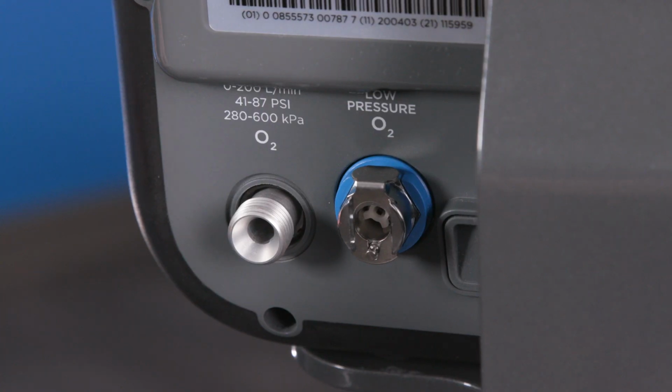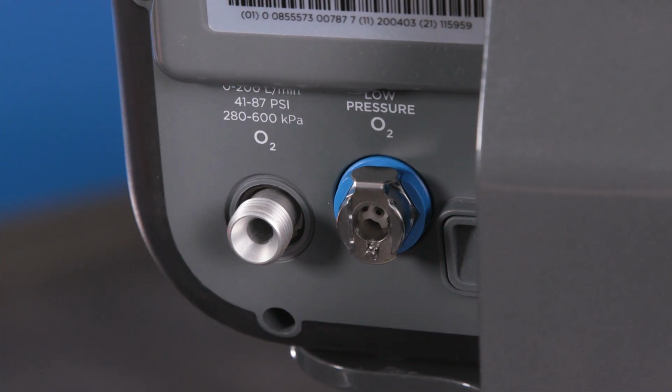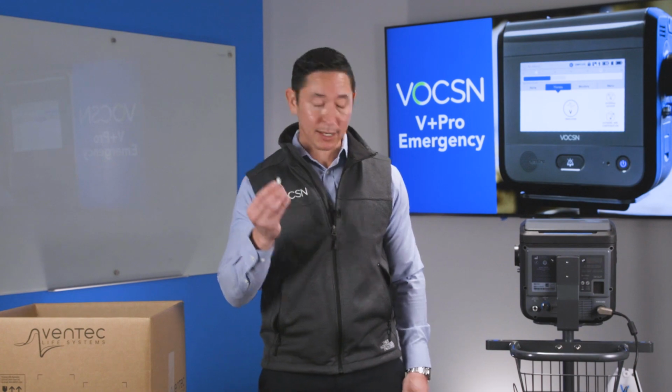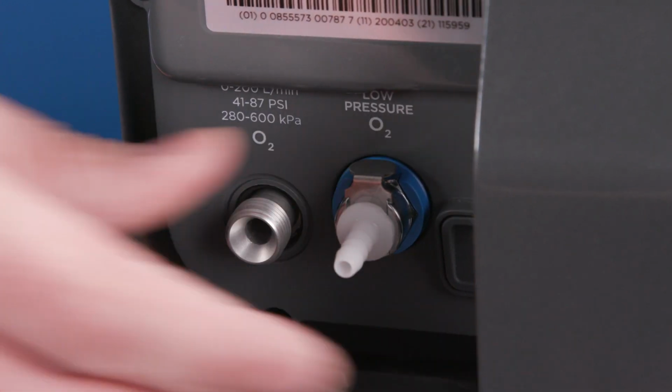The next port I'm going to show you is my low pressure O2 port. So this low pressure O2 adapter right here comes inside the box. At this point, you can connect to an oxygen tube or whatever low pressure O2 source that you have available.